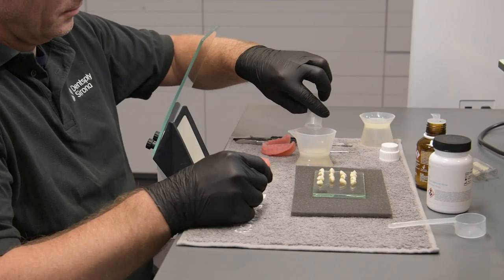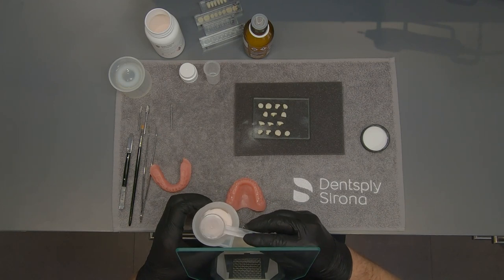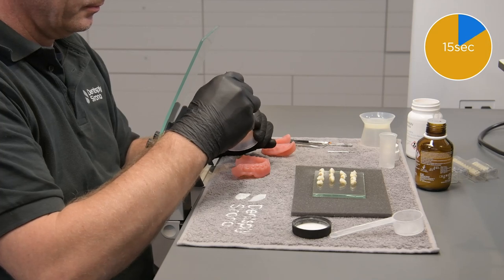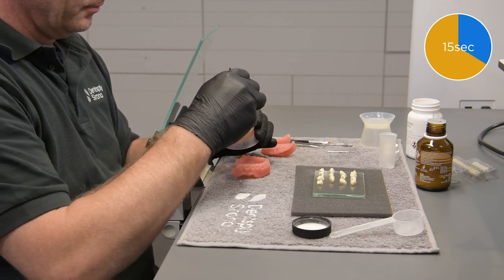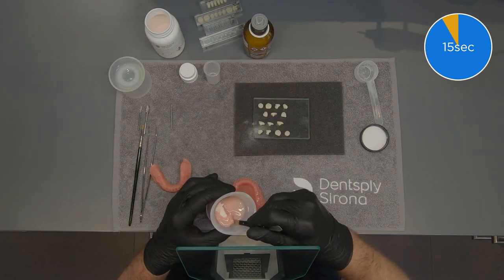Line up the teeth in the order they are to be bonded. Mix Lusitone HIPAA per the instructions for use: a ratio of 11 grams of powder to 8 milliliters of liquid. Pour the powder into the liquid and mix for a minimum of 15 seconds.